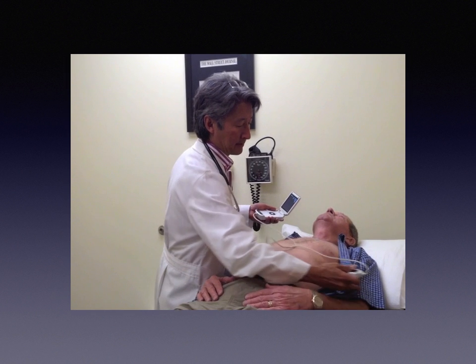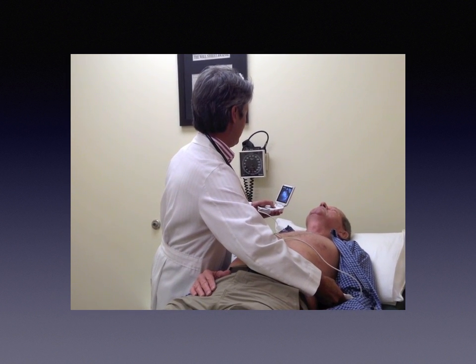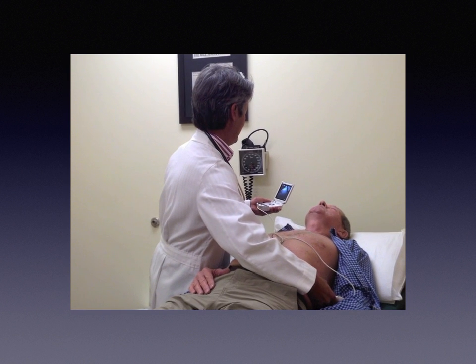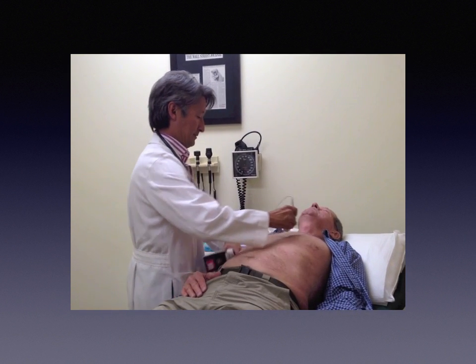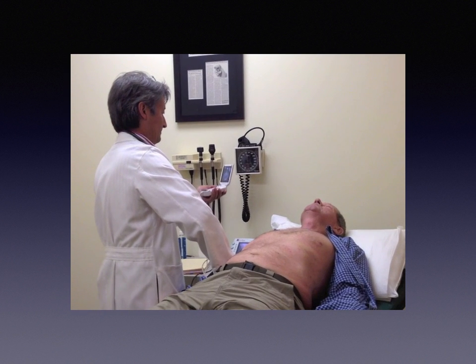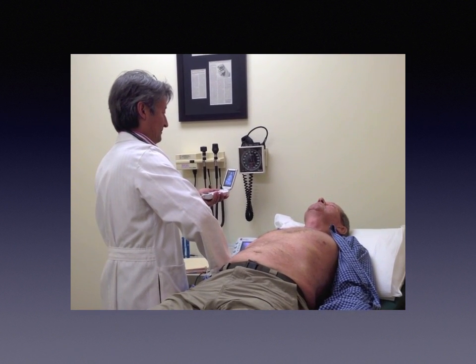So how do we do this? Well, we take a little bit of gel from that original dollop of gel, and we look with knuckles to the bed posteriorly and search for pleural effusions in the bases of the supine patient, where it tends to accumulate.